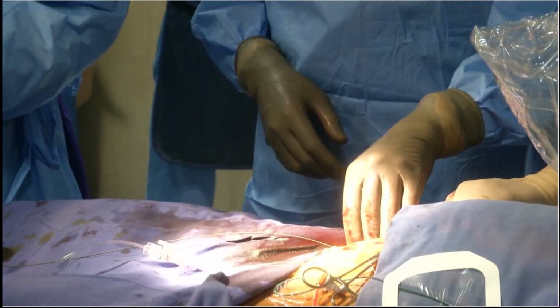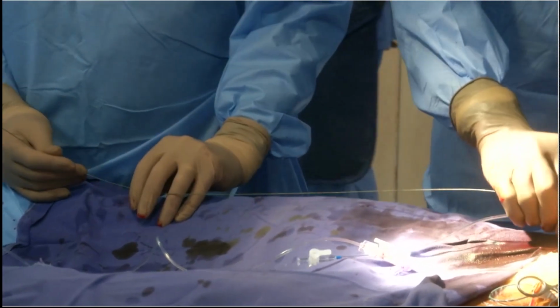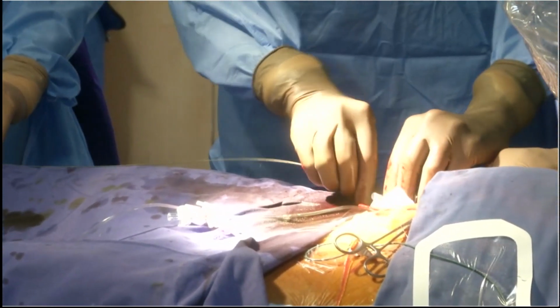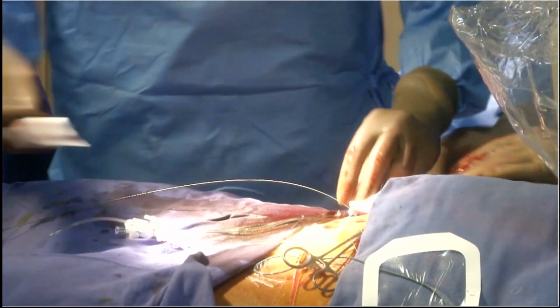On the opposite, when you have a very large vessel, 8 or 9 millimeters, usually 2 ProGlides are good, but sometimes you need a third one, or you need to complete with a non-suture device. I don't know if you have the same experience.